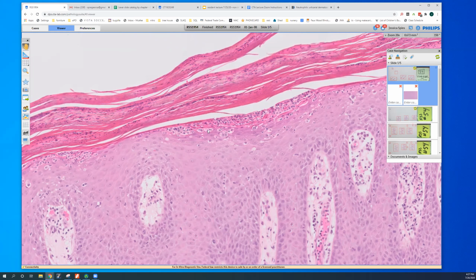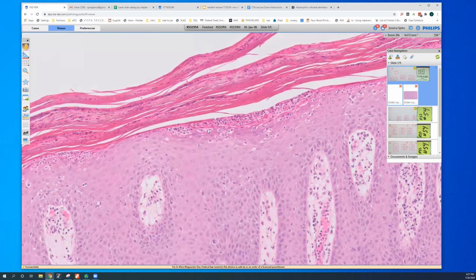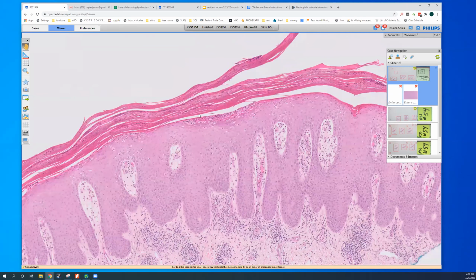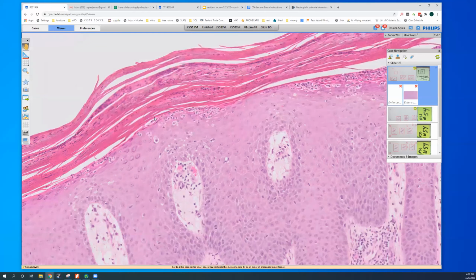When there's a lot of spongiosis with it, and I think these two particular lesions are on a spectrum, but you could call it a spongiform pustule of Kogoj. I don't know how to pronounce it. Does anybody know? Want to pipe in? I only ever read that word.